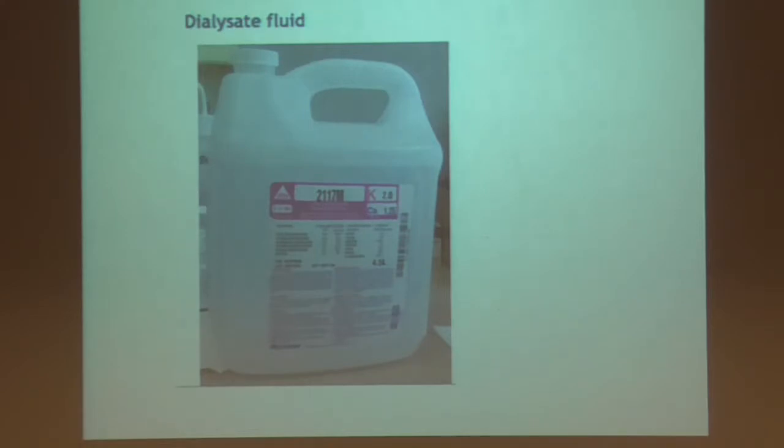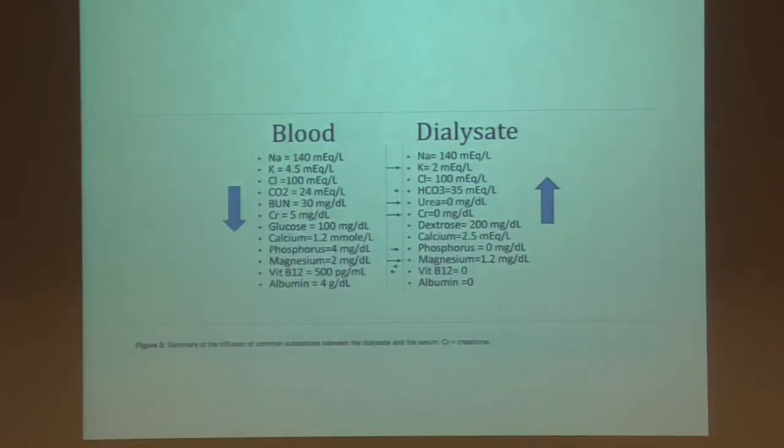The other thing is, if you have the actual CRRT machines, which I'll show you later, they all have pre-packaged bags that you get from the factory. So if you have someone with severe acidemia, because contracts will never allow you to just add more bicarb to the bags, you actually have to add a separate bicarb drip. Whereas in SLED or in dialysis, we can just dial up the bicarb, where I'll show you the buttons later. So it's a little bit easier, I find, but it's whatever you're used to in any hospital.